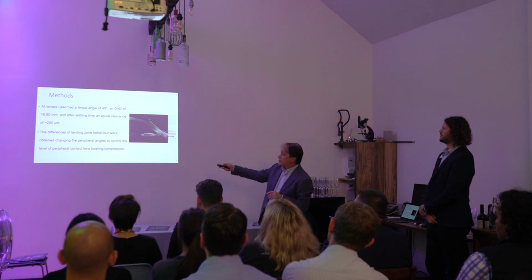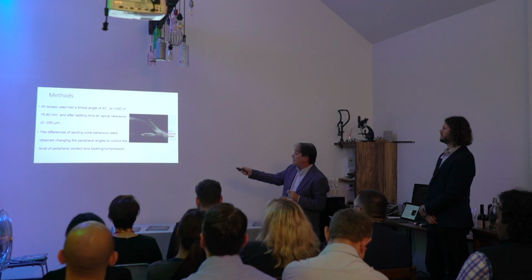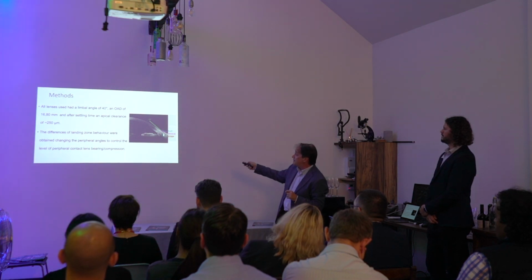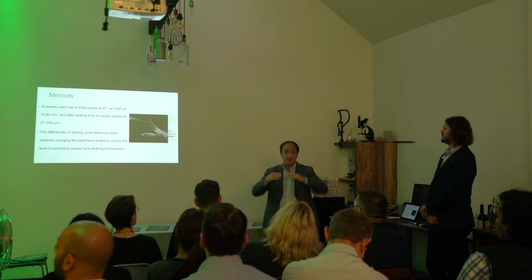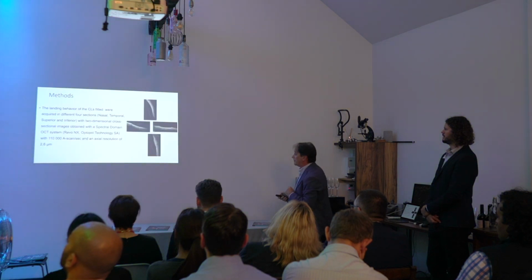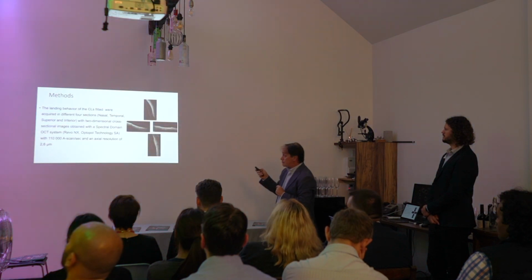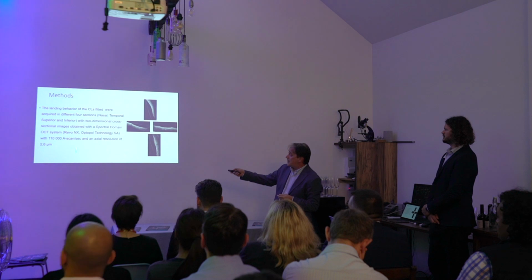And we consider a central clearance of 250 micron, and we modify the periphery to change the relationship between the lens and the sclera. And we evaluate the behavior in four different directions using an OCT.